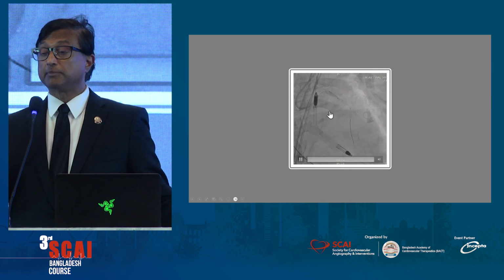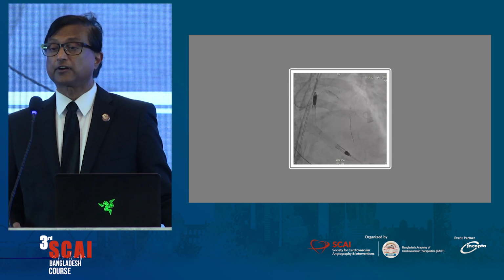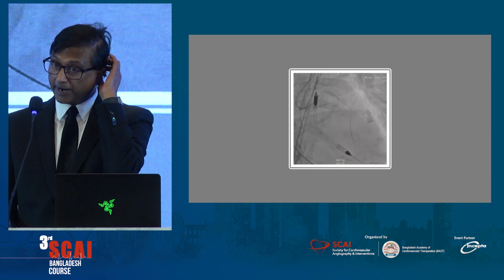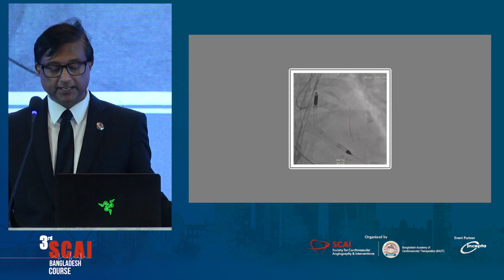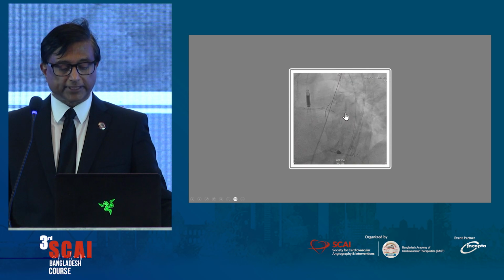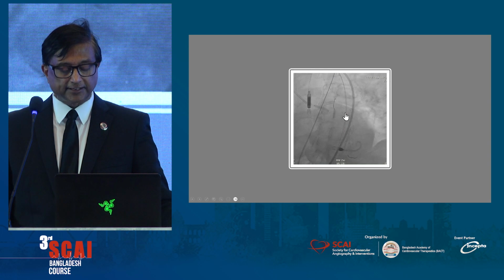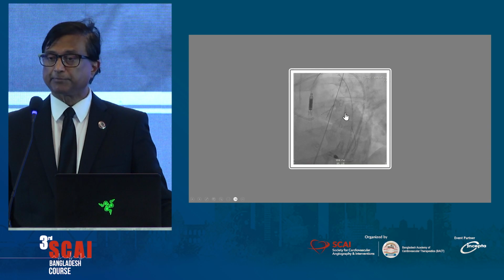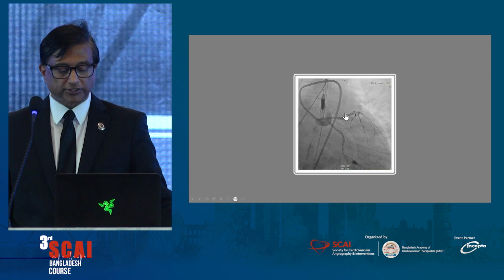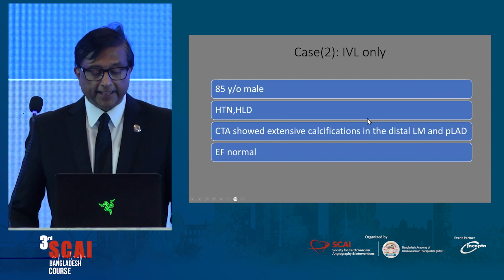But there are a few things you need to remember. With a CKD patient, creatinine, we need to be very careful about the amount of contrast used. So a lot of things are in play while we are doing this kind of complex high-risk patient. In any case, with the shockwave, we did okay, and then we did the imaging, and then, as anticipated, the circumflex may get worse. We did IVUS, and then bailout, and came out good with the left main intervention as well.